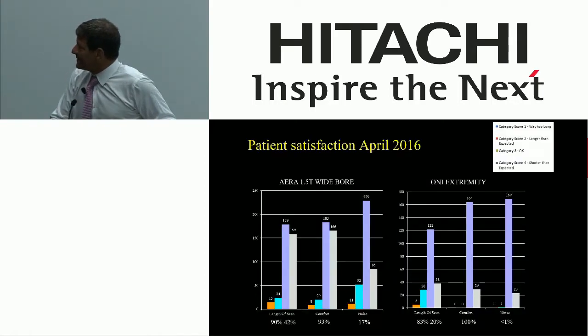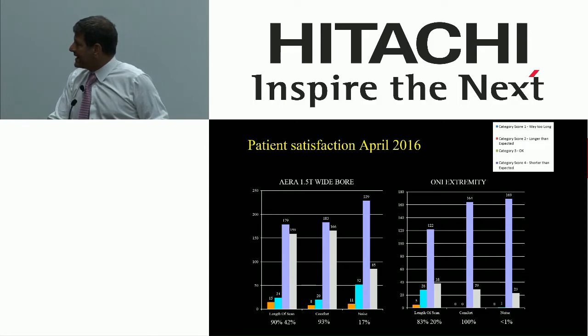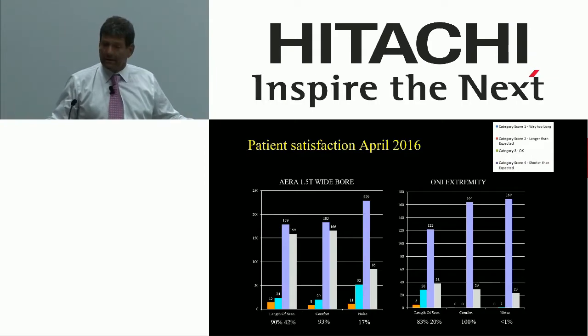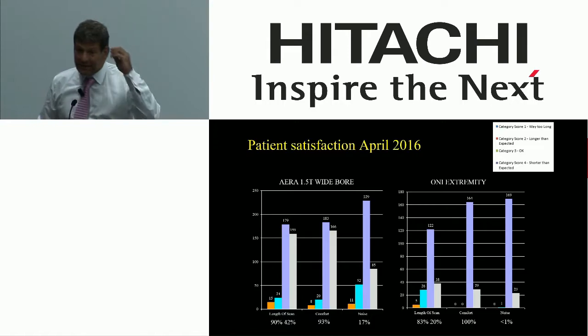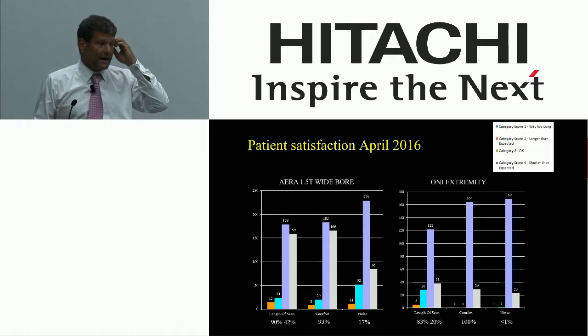Here's an interesting little bit of pseudoscience. Here's a wide bore 1.5 T against an extremity unit. Now, the extremity unit is really comfortable, right? You're just sitting there. It doesn't make any noise, right? It's not hot, but it's longer, right? Anybody have an O&I unit? It's not a short exam, right? It's a long exam. Certainly longer than a state-of-the-art 1.5 T.